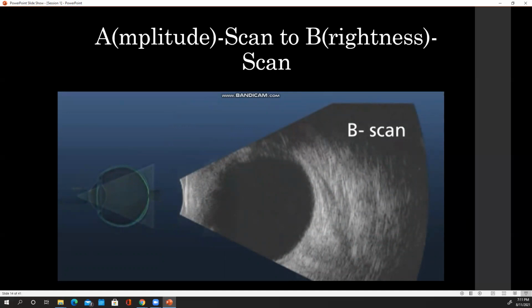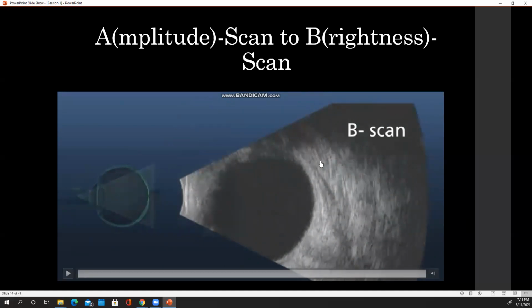It's as if I literally cut out the piece of paper of the A scan and then just dropped it down. Now, mind you, it doesn't work like that in reality. They just calculate numbers. They say, okay, well, this one's brighter, so at that point, we're going to show a bright spot pixel here. But just letting you know, that's a brightness scan.